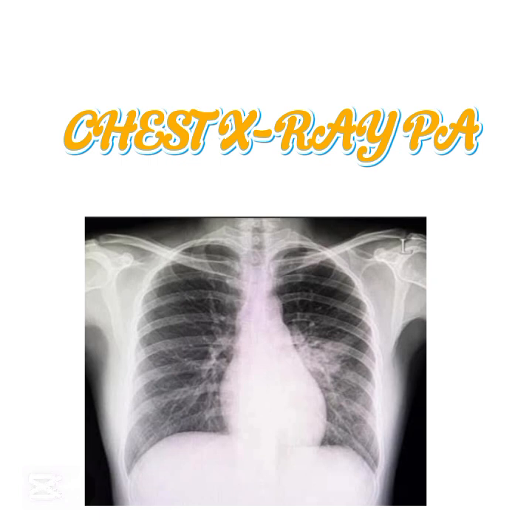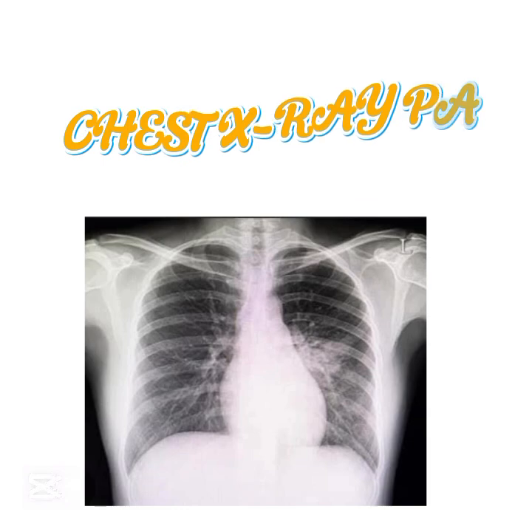So today we're focusing on the PA technique. PA means Postero-Anterior. That is the imaging of the body from the back. It's a process whereby the X-ray beam passes through the back to the front. So now let's look at the preparation.